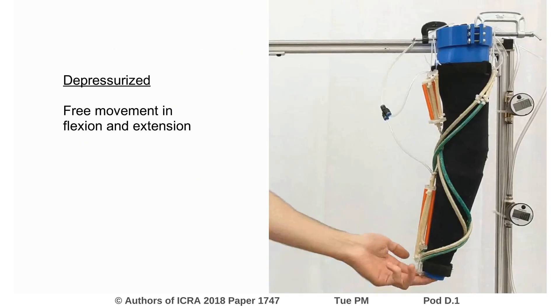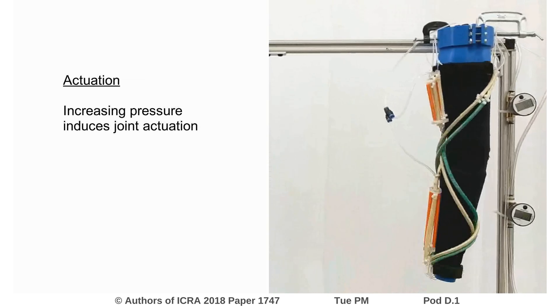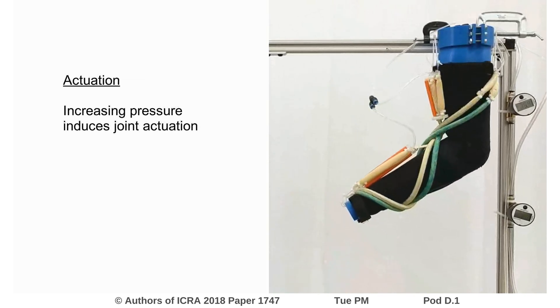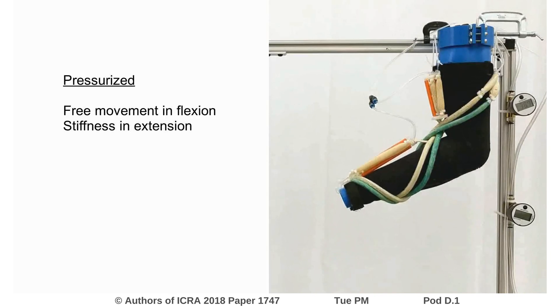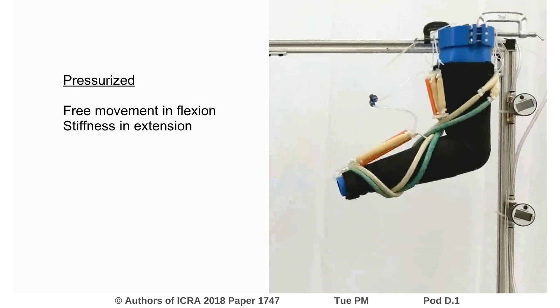This video demonstrates the basic function of the sleeve prototype. In the depressurized state, the arm is free to move in both directions. As the air pressure increases, the actuators produce a torque in flexion about the elbow. In the pressurized state, there is free movement in flexion, but increased stiffness in extension.